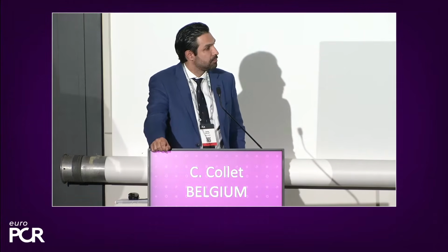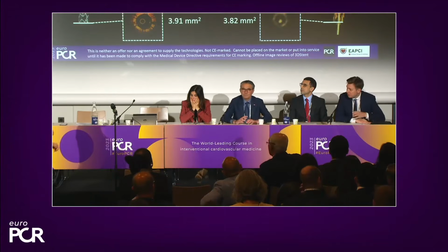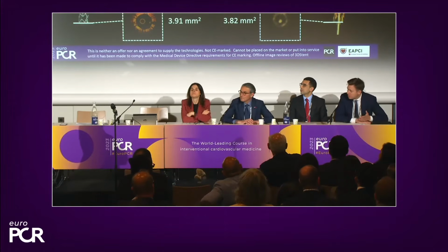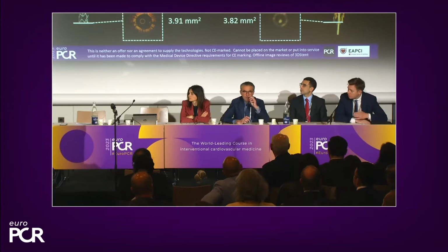Go ahead. Just one single question more about radiation, since it's rotational angiography. So there are tips and tricks how you can reduce it for the operator at least, the dose of radiation, that you step away from it and so on. So how do you see it currently?